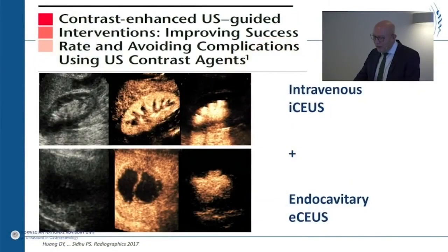You will talk about the CUS and ultrasound-guided interventions. I have the same problem as Christian also with the number of my slides, of course. And therefore, I decided to use my first slide to have the message of my lecture in one slide. And that is that using contrast-enhanced ultrasound to guide intervention improves success and avoids complications. In nearly every case, you will use it.